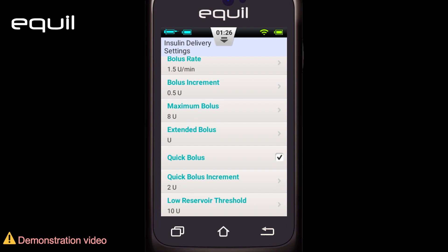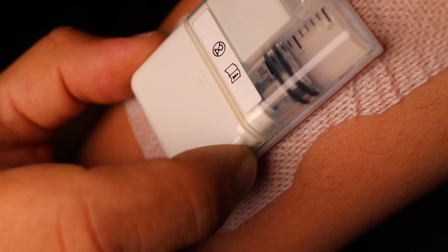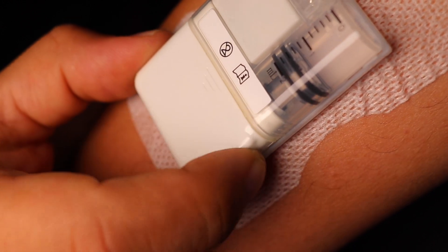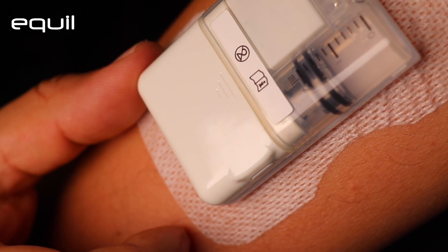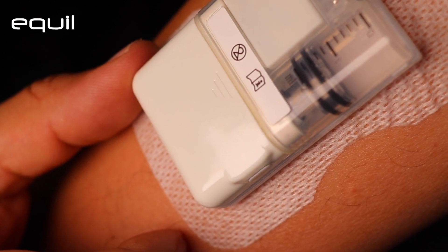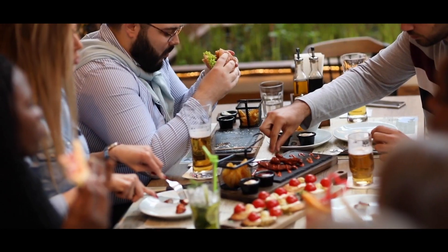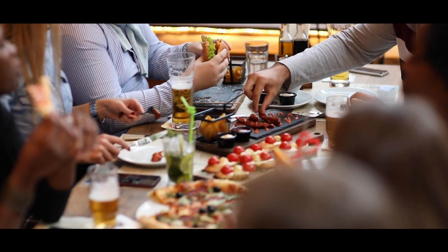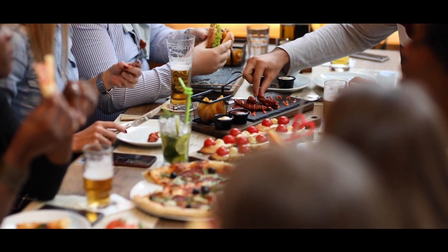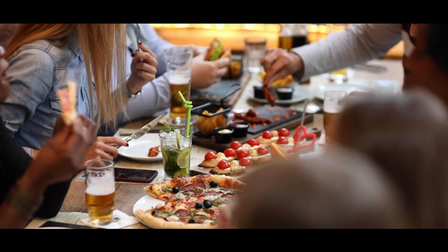The Equal Insulin Patch Pump System has a quick bolus feature. It allows the user to administer a bolus through a bolus button on the patch pump instead of using the touch screen or viewing the display on the PDA. This helps in the event that the pump user is outside and forgot the PDA, or to provide some privacy for the user.